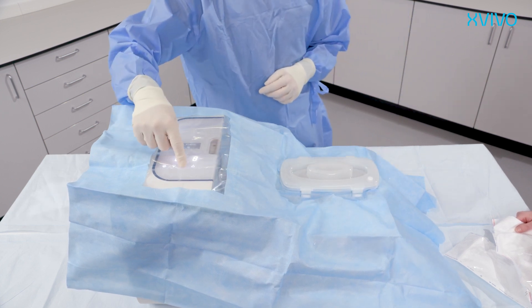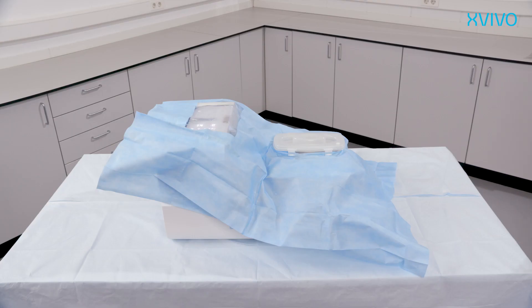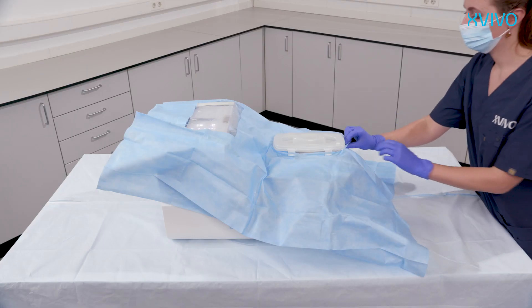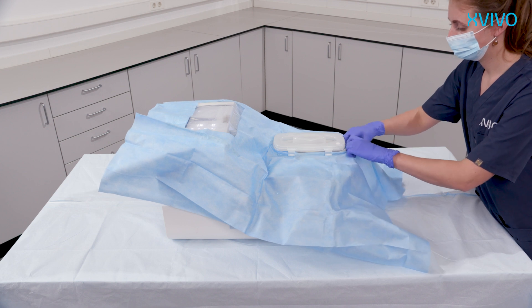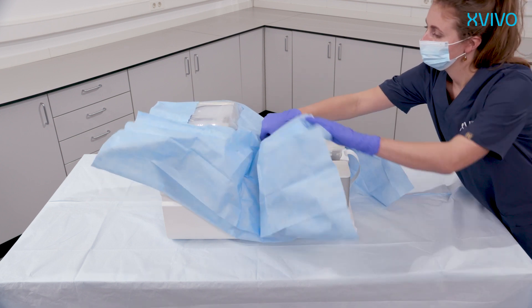Press OK to start the pressure-controlled perfusion. Wait for one to two minutes until the machine has established a stable perfusion. In case of any error, revert to the instructions for use for troubleshooting. There is also a 24/7 help desk available. When a stable, uninterrupted perfusion is established, the sterile drape can be torn away from the reservoir. Dispose it as biohazardous material.